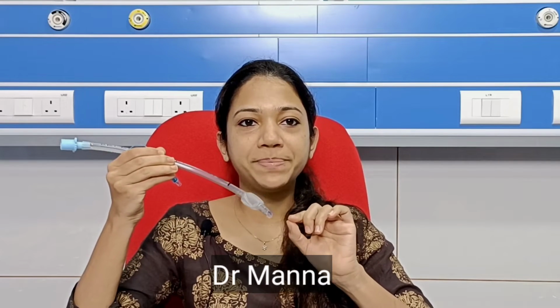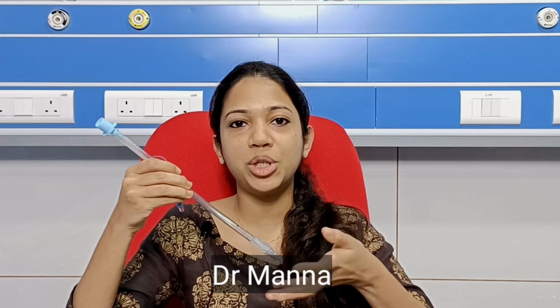There can be some vocal cord edema and post-intubation stridor. Or because of the ET tube, there can be ET tube block, or the ET tube might be hitting onto the tissues or the carina, and that can cause tissue damage. And because of the intubation into the main bronchus, there can be difficulty, or it can be because of the difference in distribution of the positive pressure. There can be atelectasis of the areas which are not getting adequate pressures. So these are the equipment related problems.